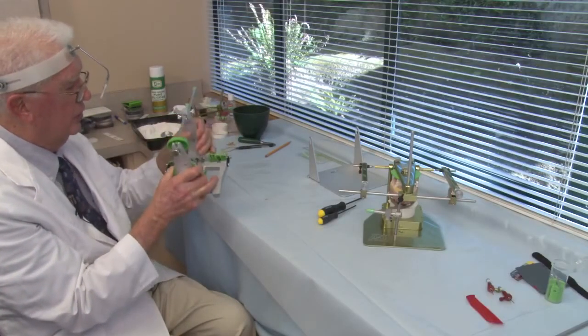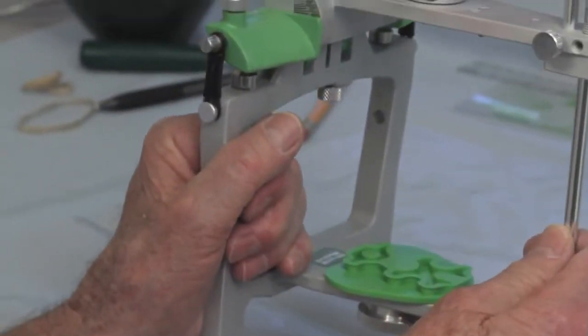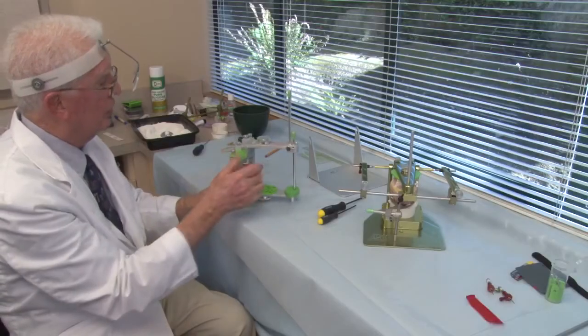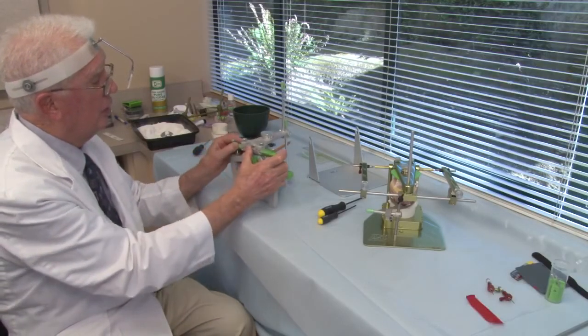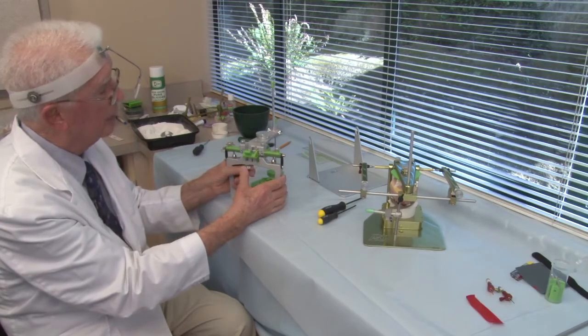Open and close. Good. Side shift. Put the centric lock back on. Centric latch, be sure you push down on the centric latch, pull down on the pin.